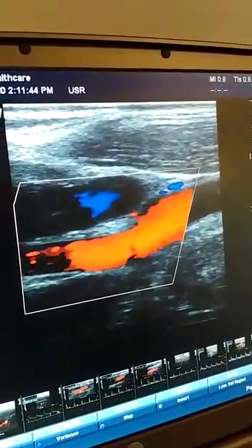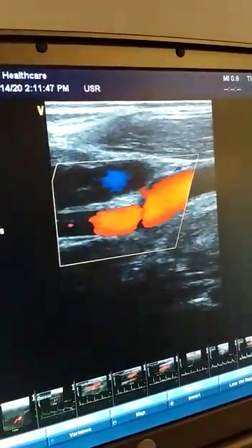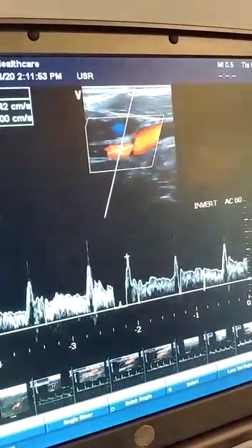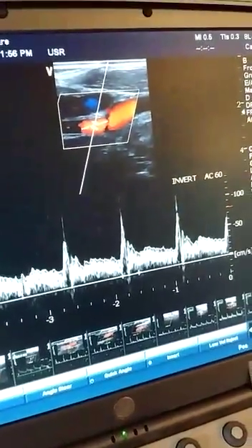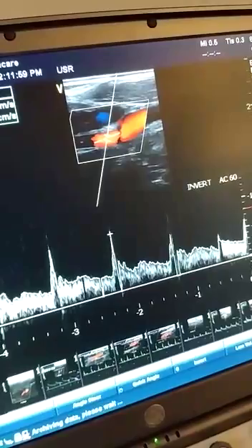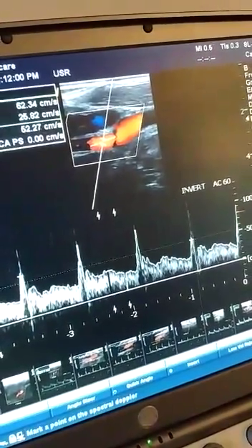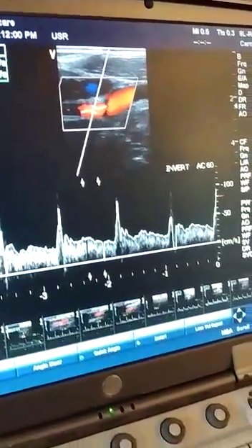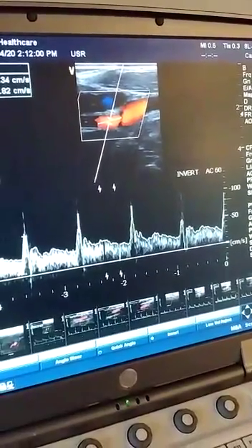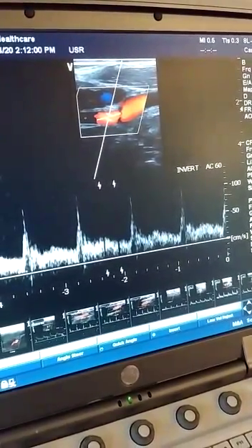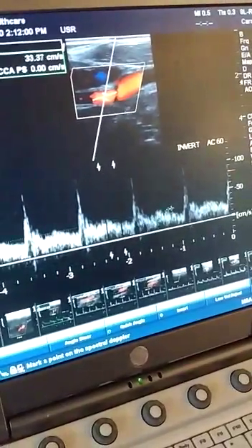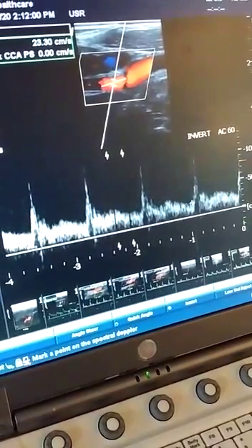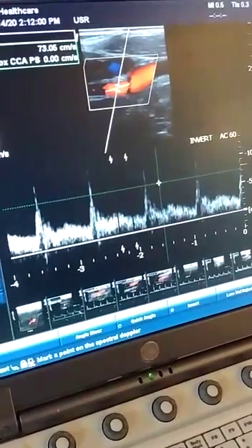Now I'm going to go into my ICA. I want you to try to remember the waveform we got from the ECA and compare it to the ICA waveform. In this ICA, you would notice that the diastolic flow is a lot more than the ECA, making the ICA a low resistance waveform. You have a lot more end-diastolic flow. So the ICA is a low resistance waveform pattern as opposed to your ECA, which is a high resistance waveform.